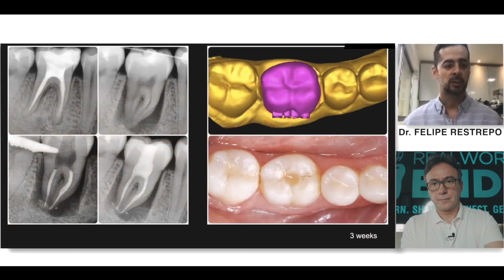And these are the X-rays. This is how you can see it after surgery. Then it's the root canal treatment. As you can see, I'm having an isolation in the next tooth, in the second molar, so I don't touch or manipulate the first one. And as you can see, it's a minimally invasive access, small tapers, because we want this to last.